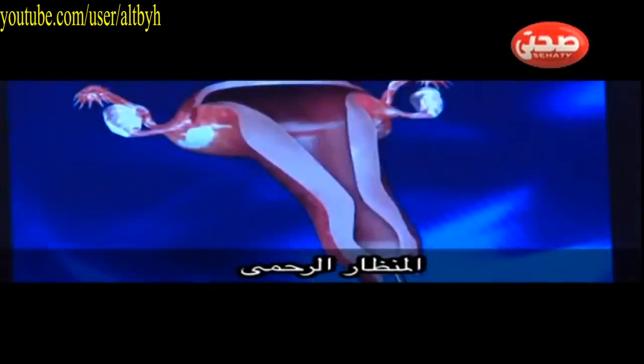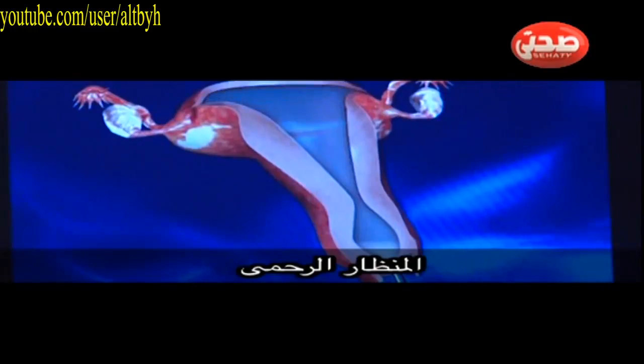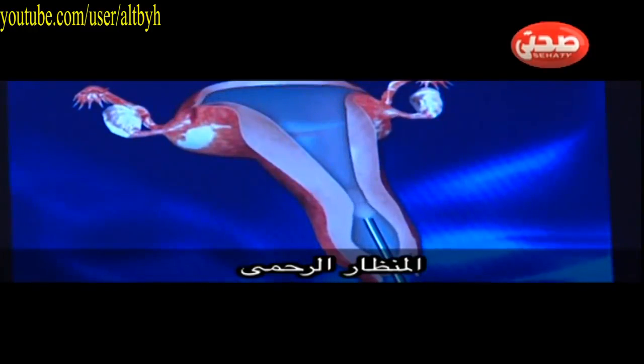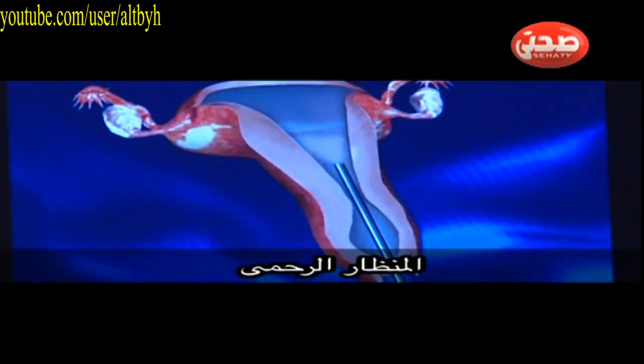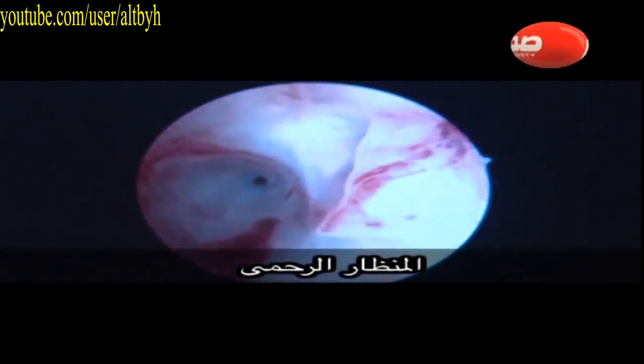Without changing or moving the hysteroscope, with a very gentle maneuver of the camera, you can see both ostia on both sides, and you have to comment on the presence of any pathologies or if it's a normal cavity. So this is the insertion of the hysteroscope, and this is an illustration of how it looks with the distending media when you look inside and the media distends the cavity and you can see the cavity inside.